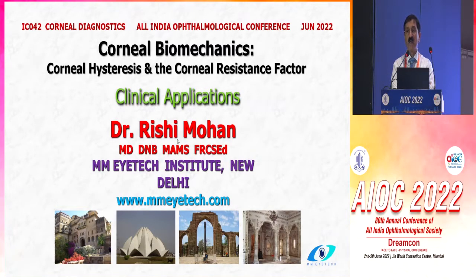It will take a while before devices like the Itrace or even devices like what I'm going to speak of on corneal biomechanics will find their way into every clinic. But we can already see how OCT has penetrated into a deeper segment and how the Scheimpflug based systems will also come in. So I think it's a healthy trend in that sense.